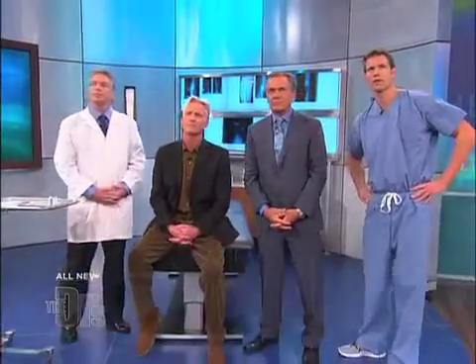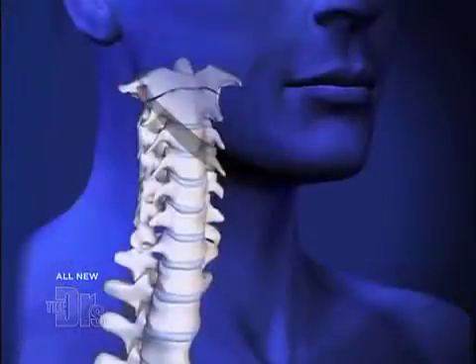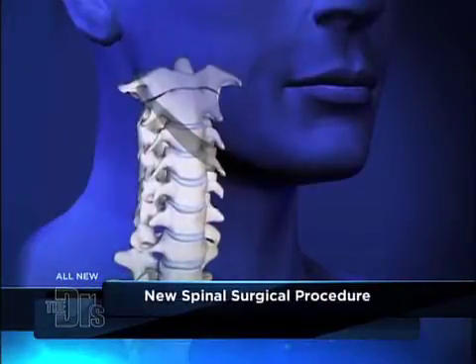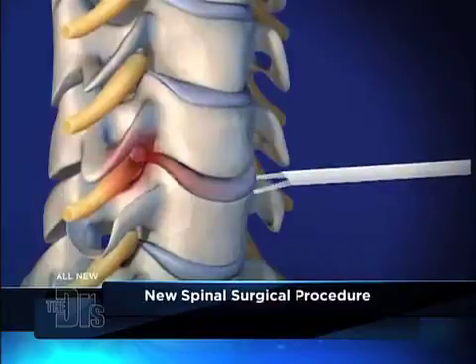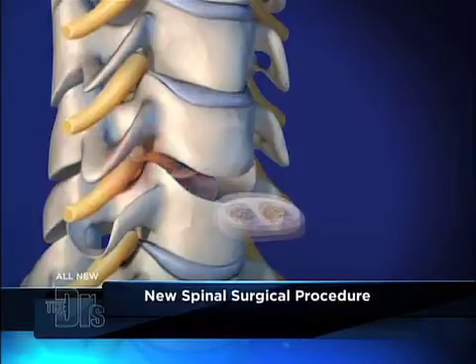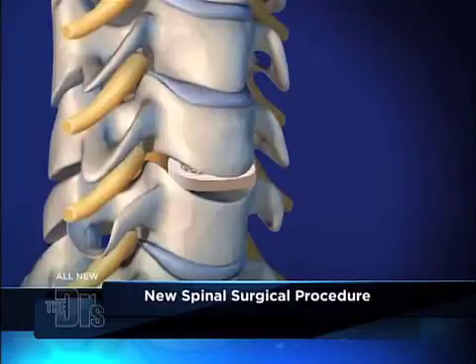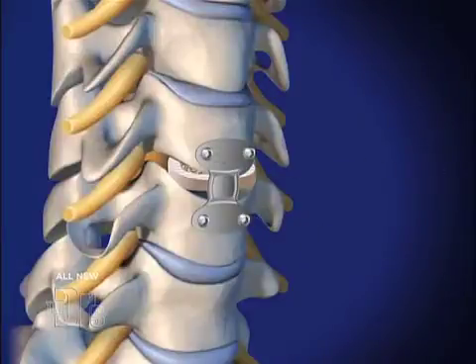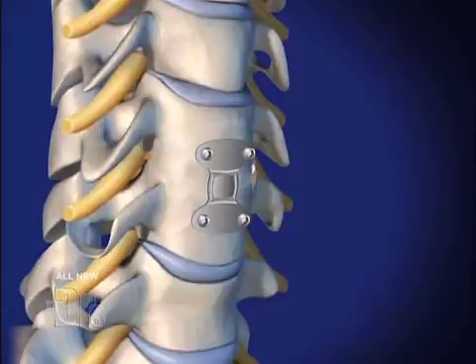Go ahead and walk us through this, Dr. Armstrong. So we approach through the front of the neck, push the delicate structures out of the way, and come right down to the disc. We take out the disc — all of this is done under the microscope. We then put in a physiologically shaped spacer with a bone cell or stem cell product that helps the fusion. We hold it all together with a titanium plate, put on the screws, and then over the next three to four months the bone will knit together and make a solid fusion.